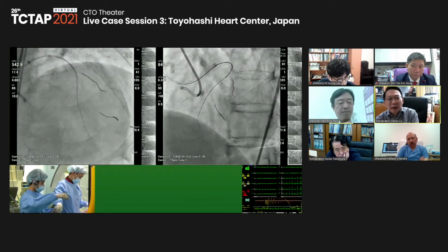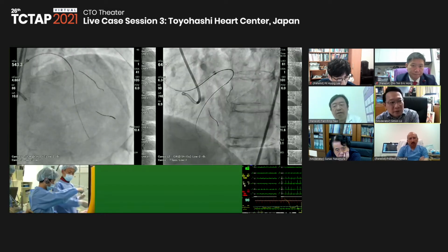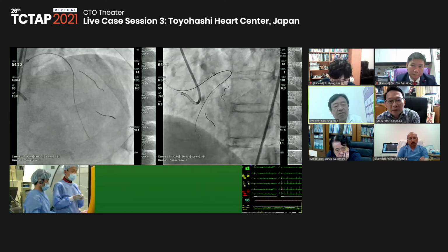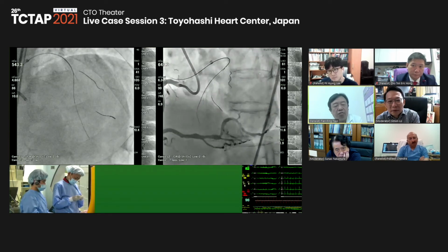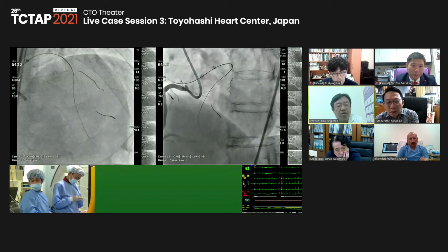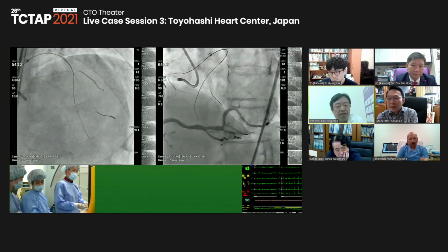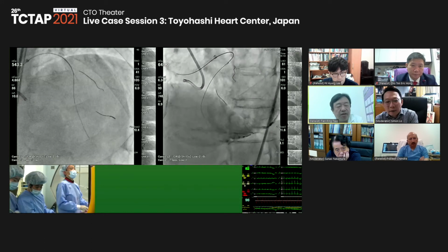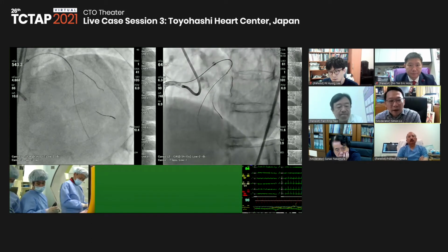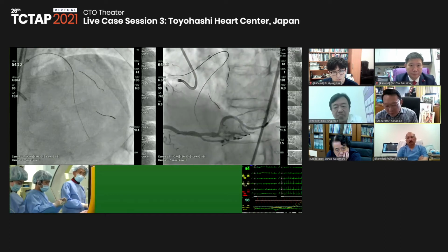And you do a kissing balloon then? Depends. Probably if the ostium is severely compromised, maybe use kissing balloon, then DCB or probably second stent. Yeah, I see. Dr. Hong?